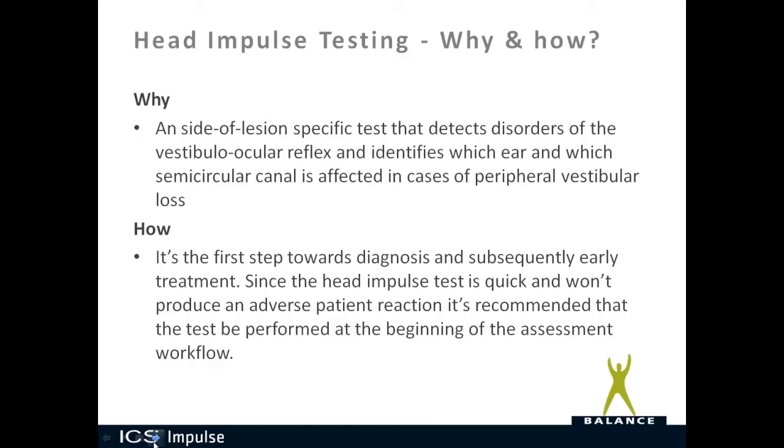How do we do it? Well, we recommend that it's the first step towards diagnosis and subsequently early treatment. Since the head impulse test is quick and won't produce an adverse patient reaction, it's recommended that the test be performed at the beginning of the assessment workflow.